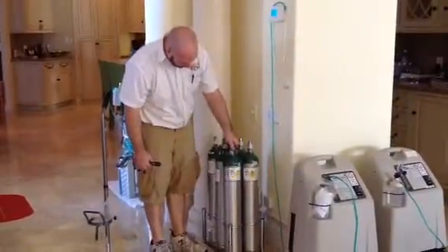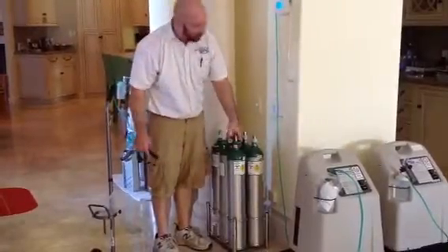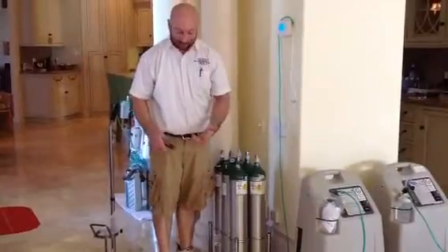These here are your high pressure cylinders. You will see the gauge reads 0 to 2,000 psi, 2,000 being full, and they hold approximately 680 liters.